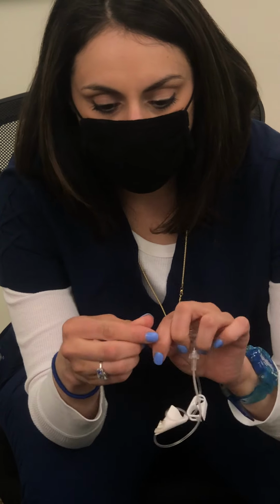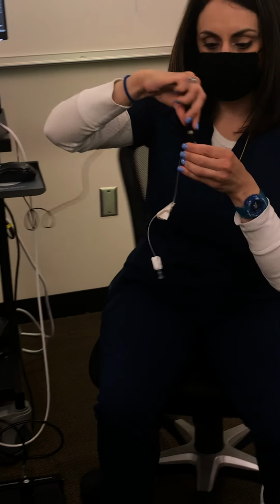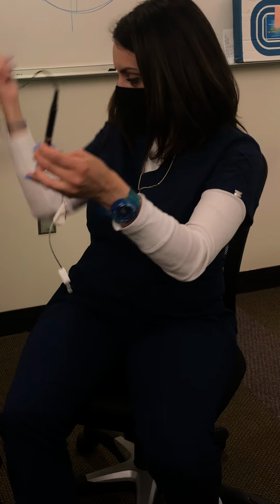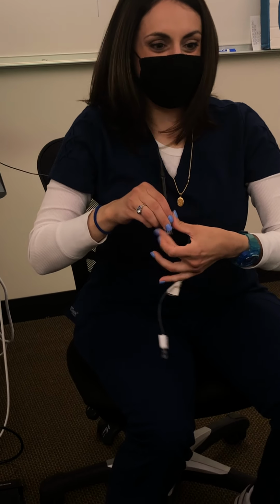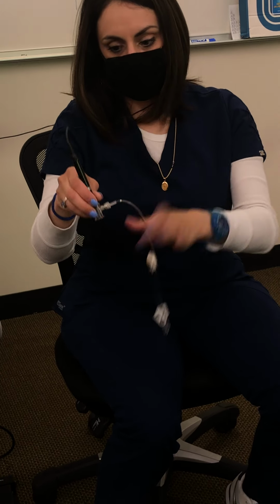Okay, so you're gonna screw this end on there with the thumb knot. This end will connect to your BSS bottle, and then this goes in here. It's hard because you don't have a lot of room. That's what I do, I just put it around, because it's one less thing. You don't want this dangling all over the patient.